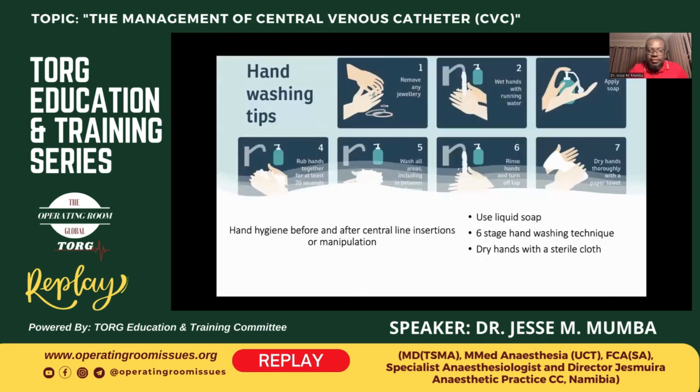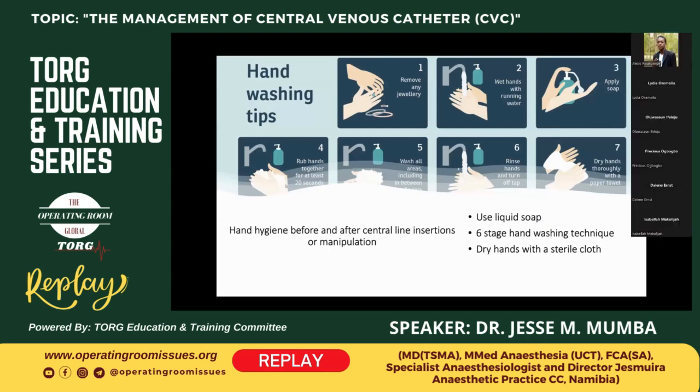So first things first, and I think most of us work in the theater, as the name of the organization suggests. This is something that is familiar to us, but we need to re-emphasize that hand hygiene, not only when inserting the central line, but before and after use of the central line, is very much important in terms of avoiding central line associated infection.